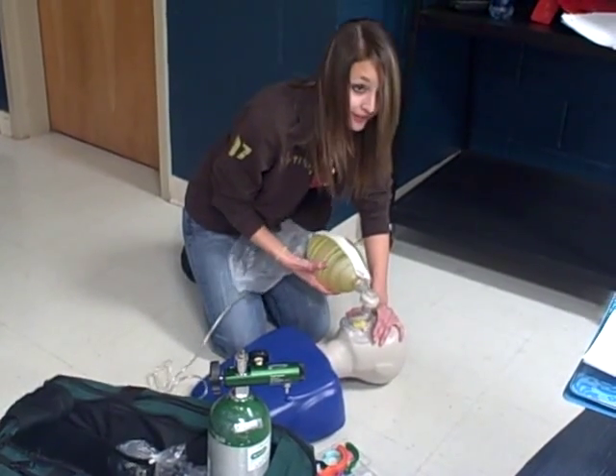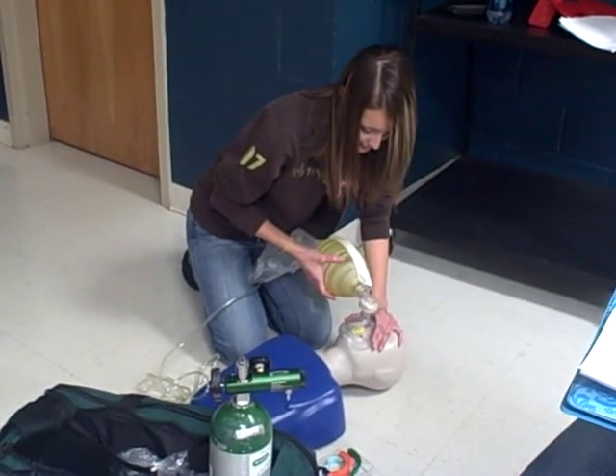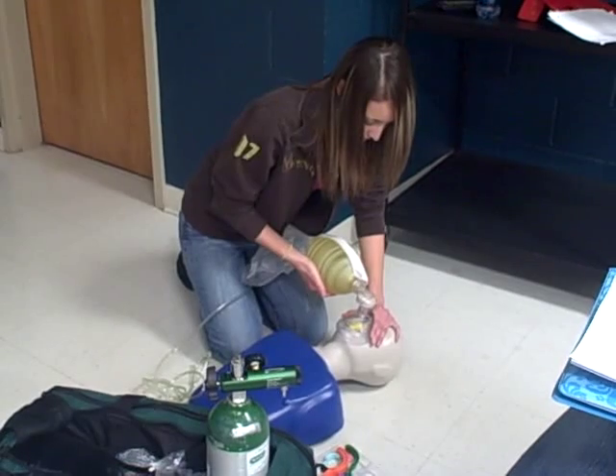And we will ventilate for 30 seconds. One one-thousand, two one-thousand, three one-thousand, four one-thousand, five one-thousand.